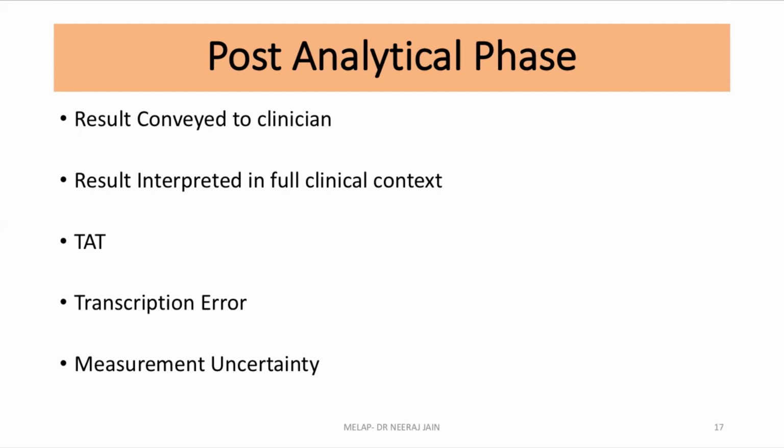You should have adequate history. Suppose previously the prothrombin time was 1.8 and the clinician wants to maintain between 2 to 3. You discuss with them. If they are sending a prothrombin time again, you shall have adequate history whether they have increased the dose in recent time or not, so that you are able to correlate.